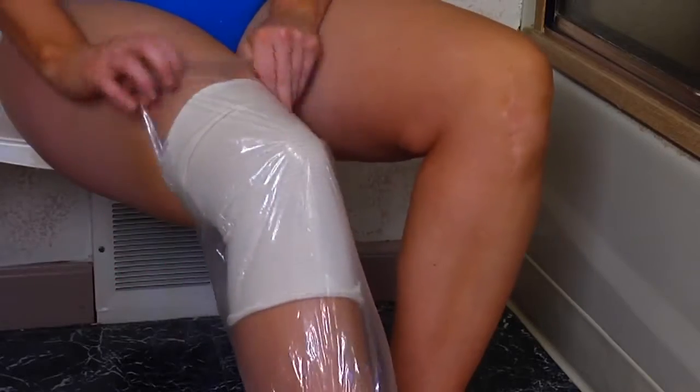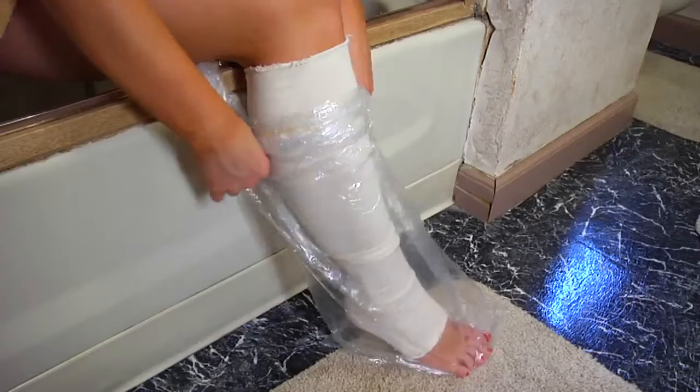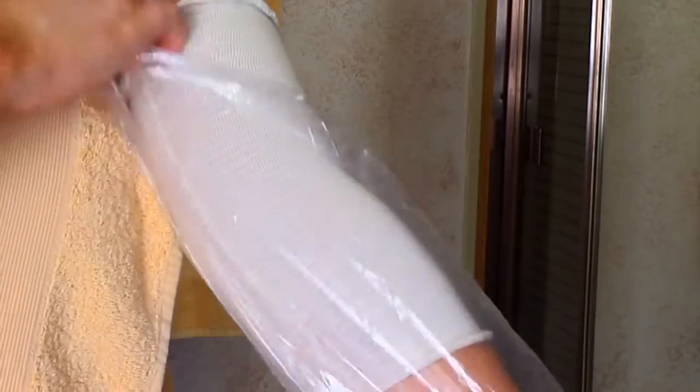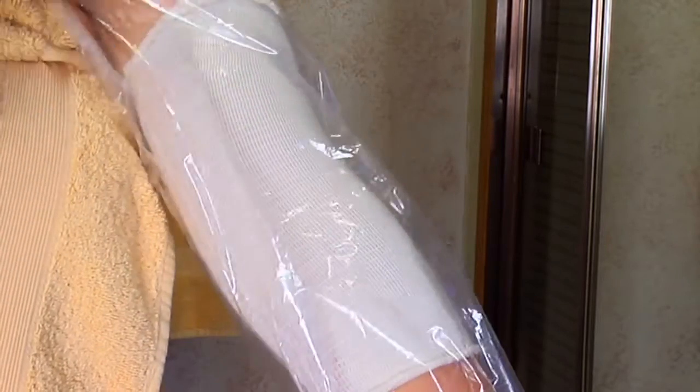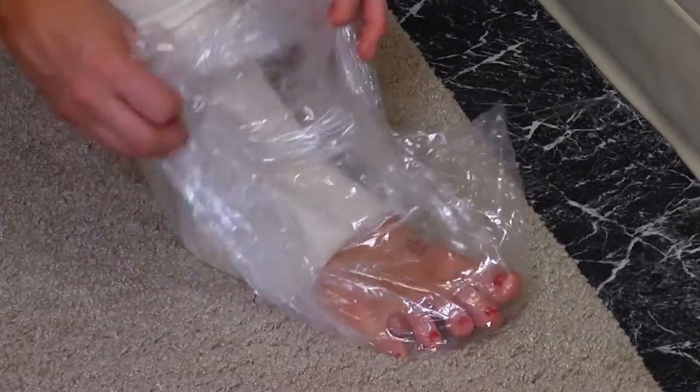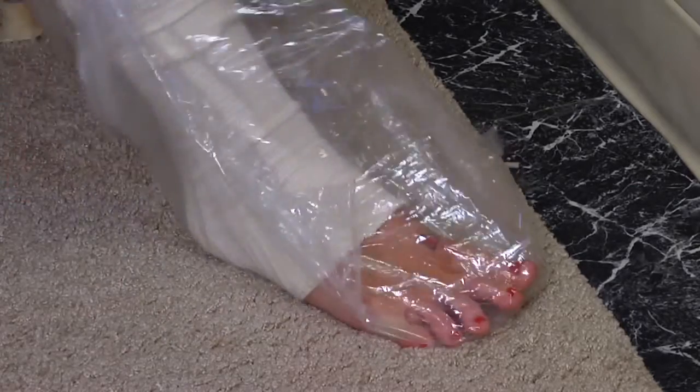It's easy enough for children to use. After showering, patients can simply remove the sock and throw it away. The elbow shower sock is great for pick lines, and the hand, knee, and foot shower socks are also useful for orthopedic, dialysis, and burn victims.